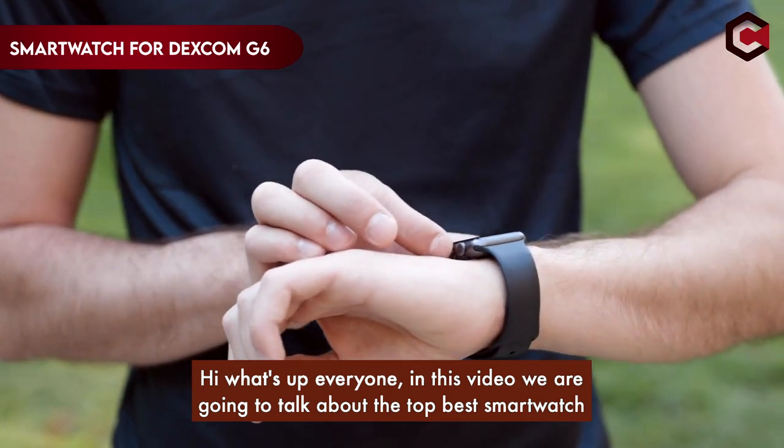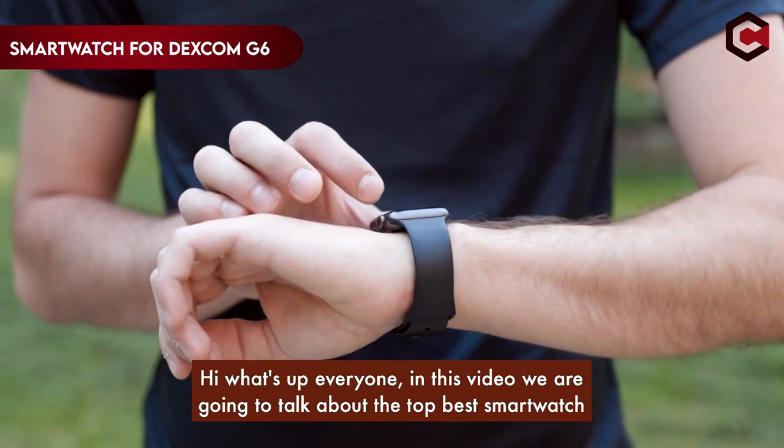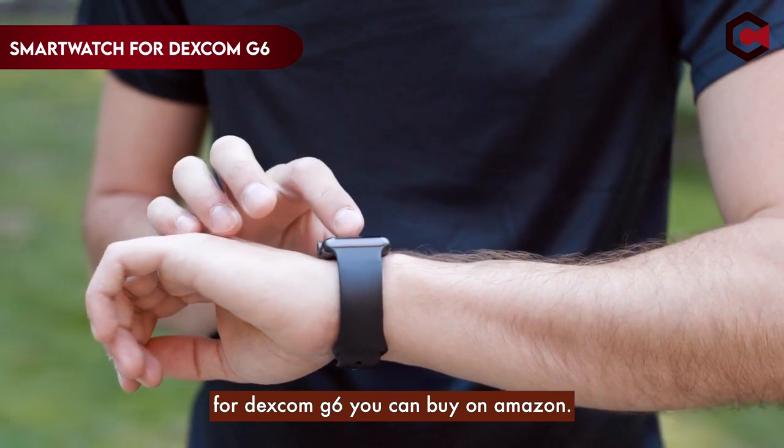Hi, what's up everyone! In this video we are going to talk about the top best smartwatches for Dexcom G6 you can buy on Amazon.